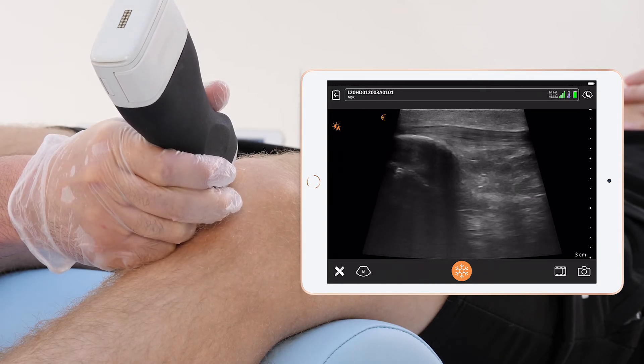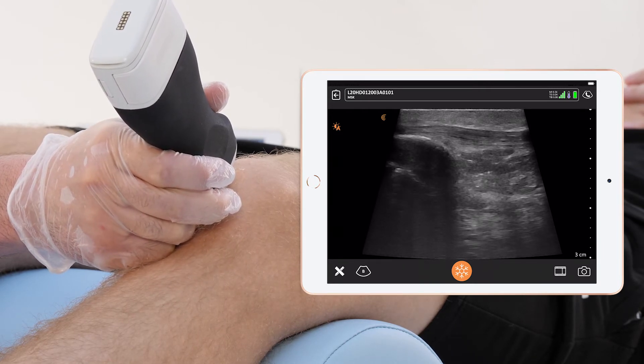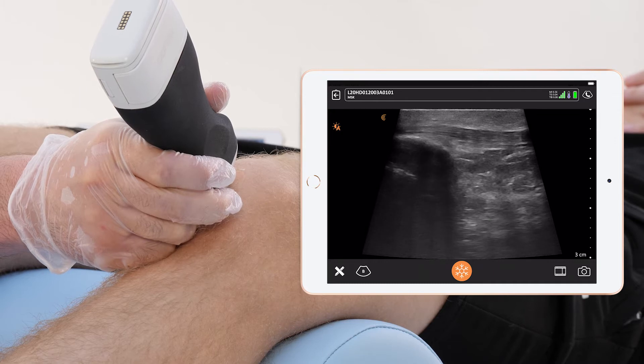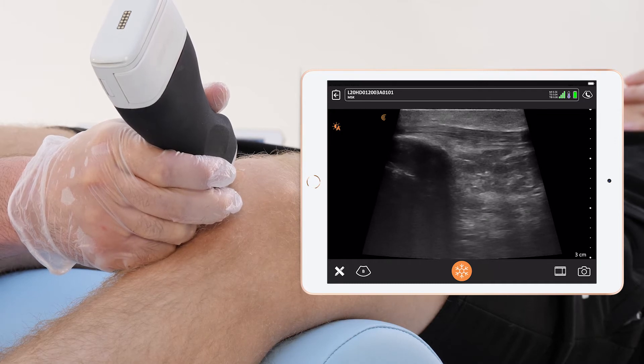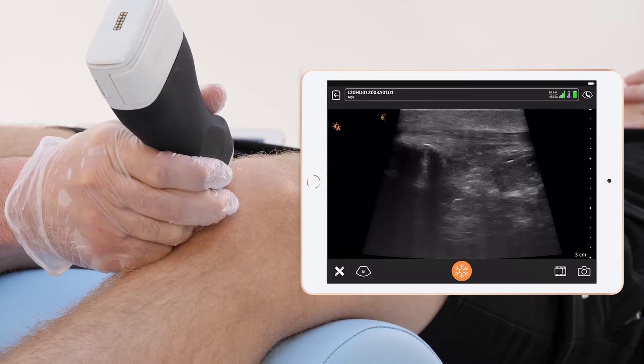This is a renowned spot for changes to the patella — pathological changes due to overloading and overuse injuries.